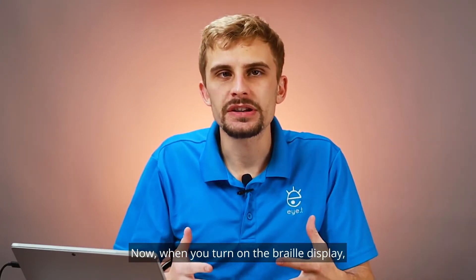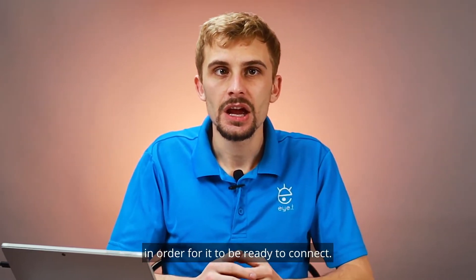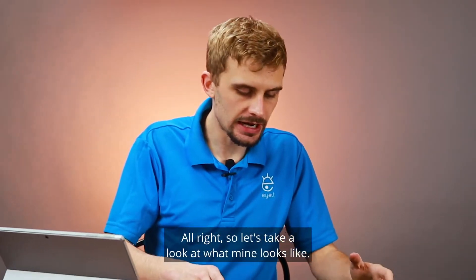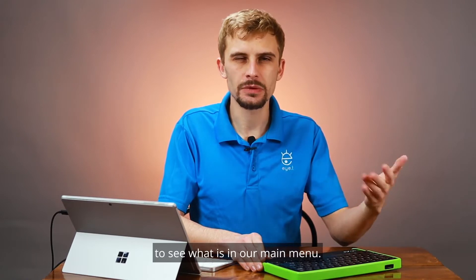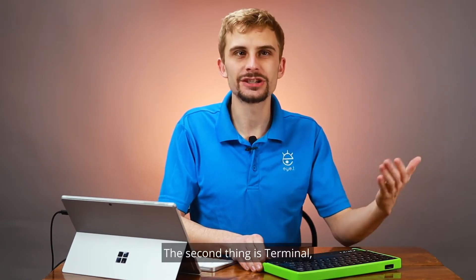When you turn on the braille display, you might need to go through a few menus in order for it to be ready to connect. What you'll be looking for is usually 'braille terminal' or 'terminal mode.' Let's take a look at what mine looks like. I'm just reading braille visually here — it says 'editor,' and I'm going to use my thumb key to see what is in the main menu. The second item is 'terminal,' and that's what I want.